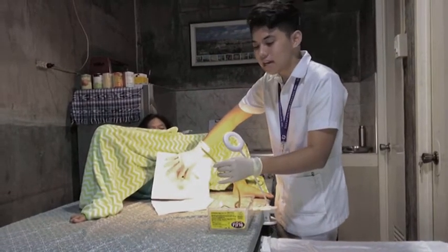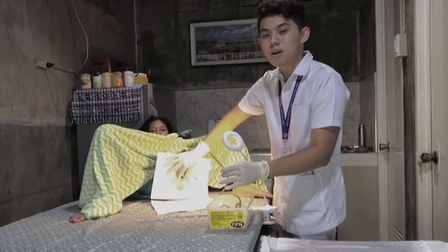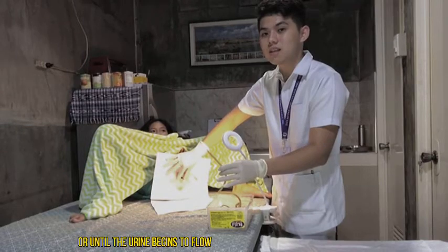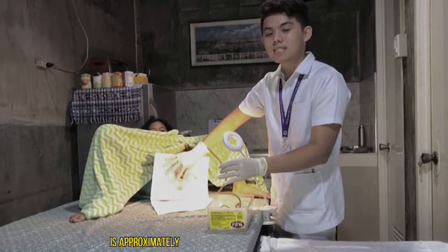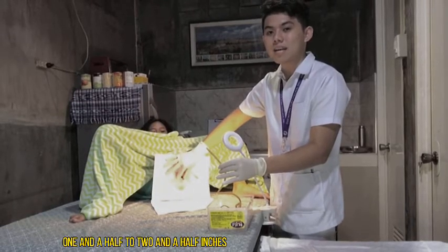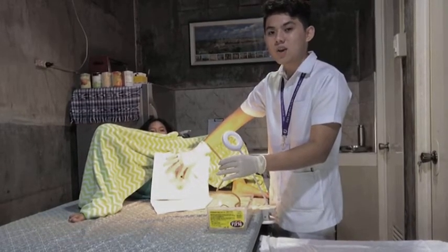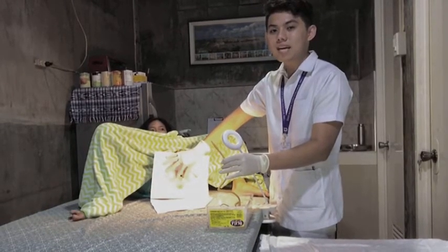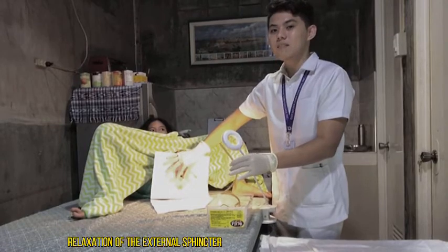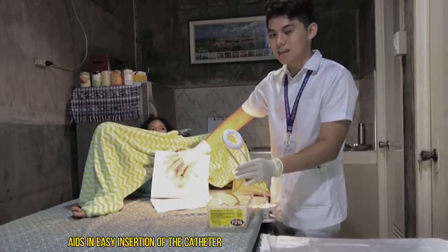So this time, you will be inserting the catheter into the meatus for 2 to 3 inches or until the urine begins to flow. So the female urethra is approximately 1.5 to 2.5 inches. So, of course, while inserting the catheter, we need to encourage the patients to breathe deeply and relax because relaxation of the external sphincter aids in the easy insertion of the catheter.